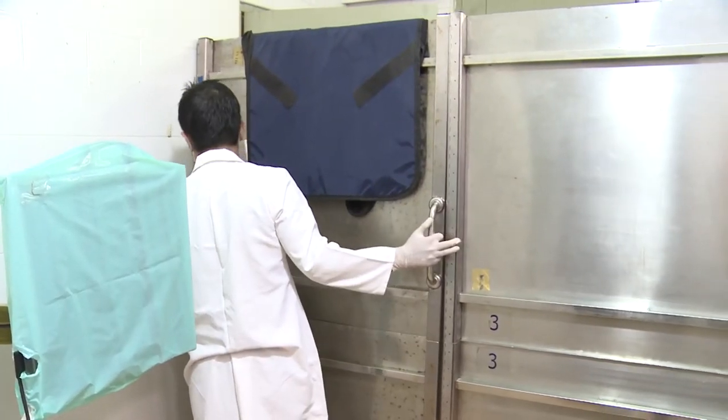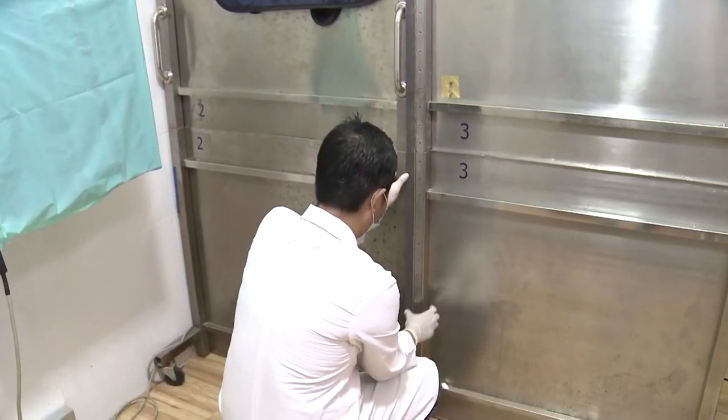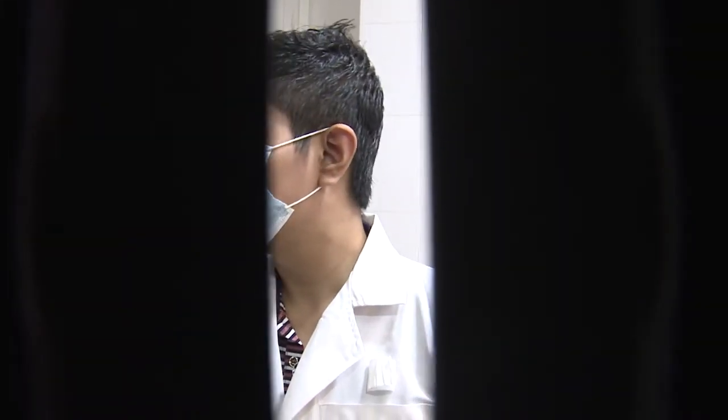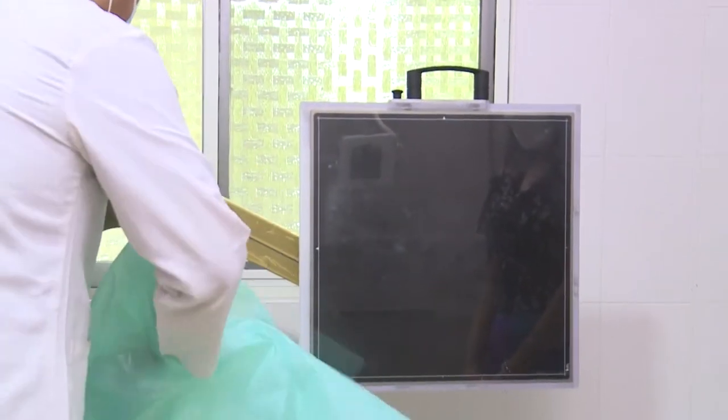Before taking a chest x-ray, make sure the lead shields used in the mobile x-ray room effectively protect against radiation leakage. Also, cover the detector with an easy-to-clean plastic sheet to reduce the risk of infection from one patient to another.